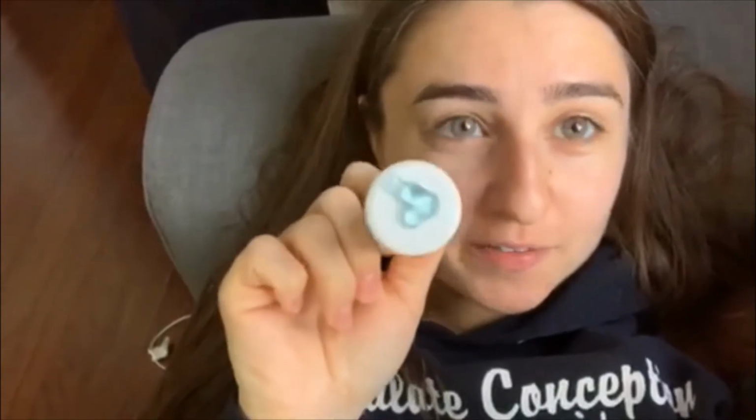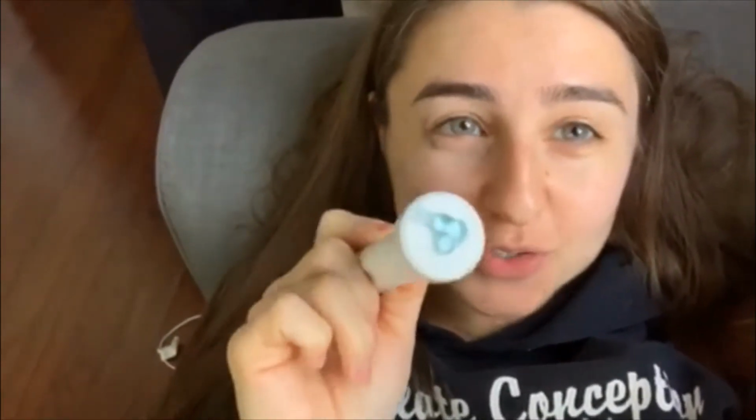Now, I'm gonna try not to make this too graphic because the baby's really low, okay? So bear with me. The Doppler comes with this little gel stuff that you put on it. You don't have to use this stuff. You can use aloe vera or something else, but since it came with it, I use it. So here we go. I'm gonna turn it on. It is a little loud, so don't get annoyed by the sounds.